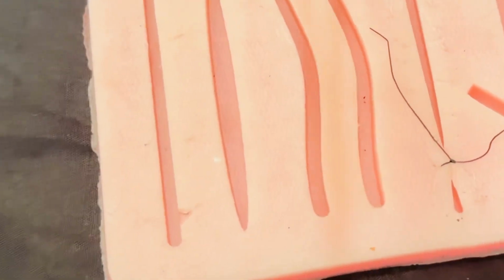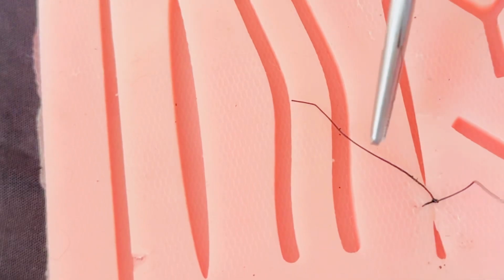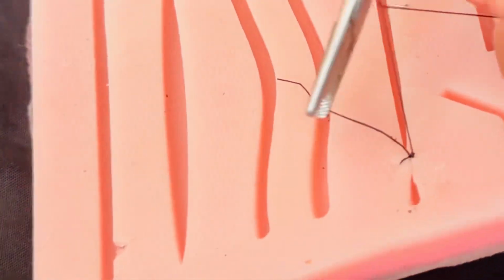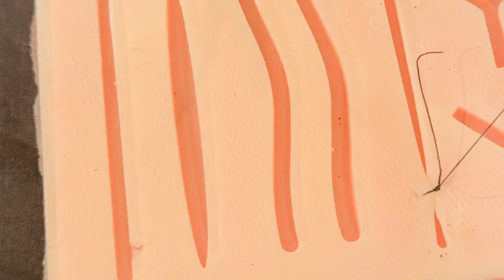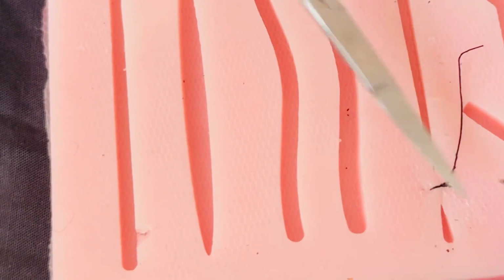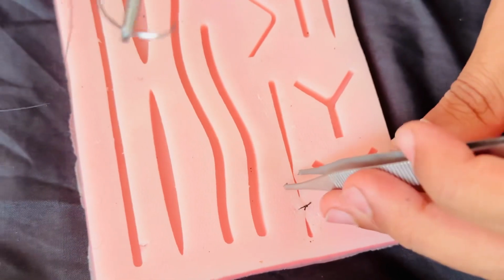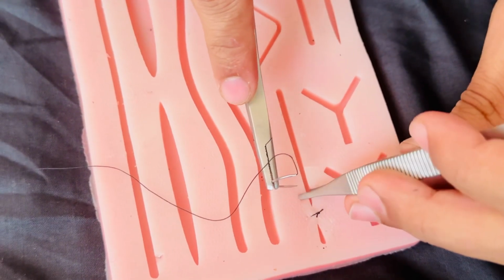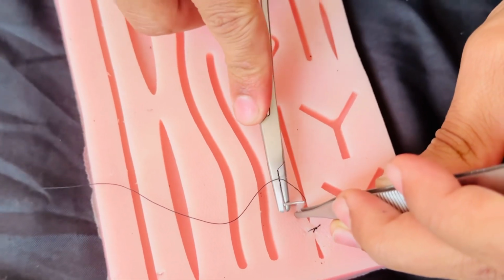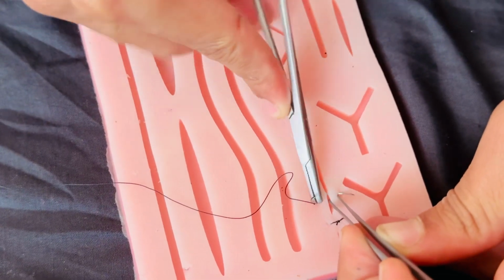And to assure a beautiful symmetry, always give the knots on one side of the wound and make sure to keep the tension even and the stitches evenly spaced. Now take the scissors or blade and cut both ends of the thread like this. Now again perform all the steps in a similar manner as you have performed previously. Insert the needle on one side of the wound and take it out on the other side like this.